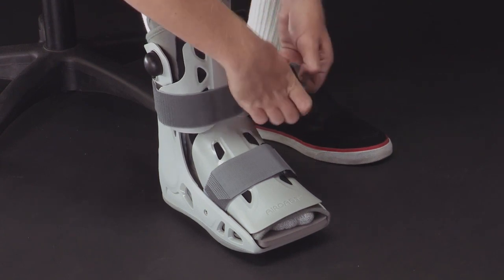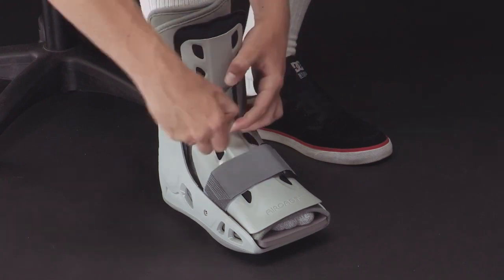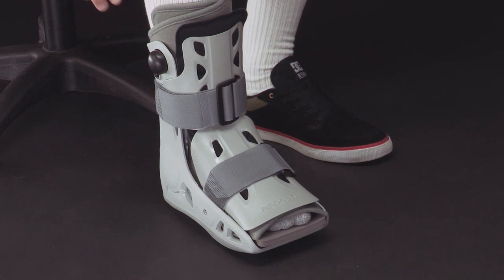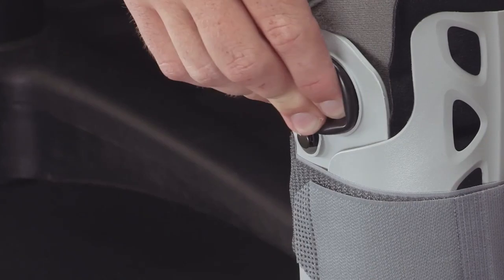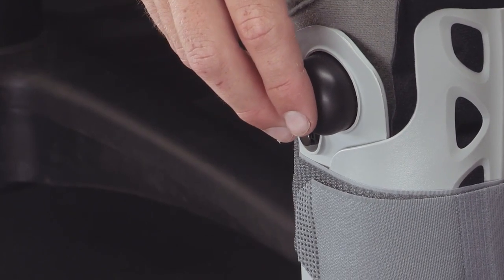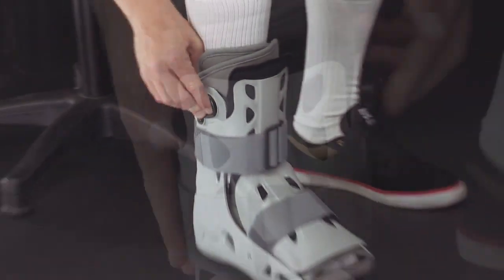To adjust the AirSelect short for a proper fit, you'll need to inflate the air cells. Begin on the injured side of your leg. To inflate the air cells, place a finger over the small hole on top of the large inflation pump, and then press and release the large inflation pump on either side of the boot. Pump until the air cell feels snug but not excessively tight. Repeat the process on the other side of your leg.